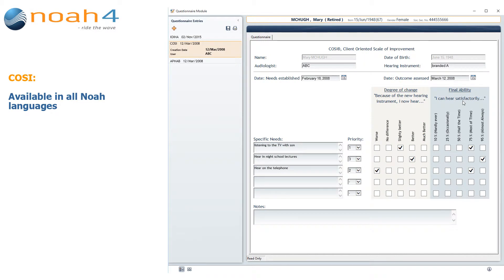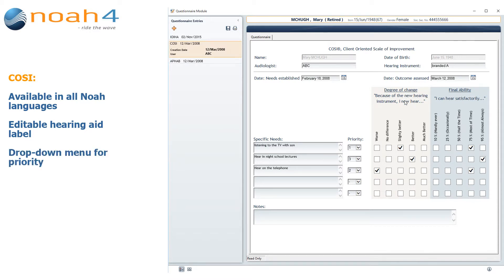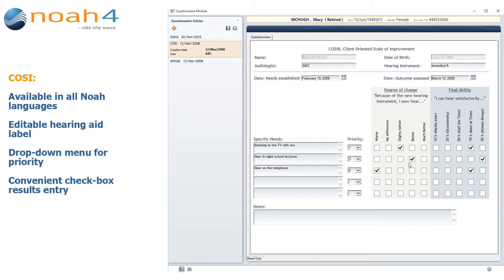The COSI questionnaire is available in all NOAA languages. COSI offers an editable hearing instrument label, drop-down priority menus, and a convenient checkbox mode of entry.